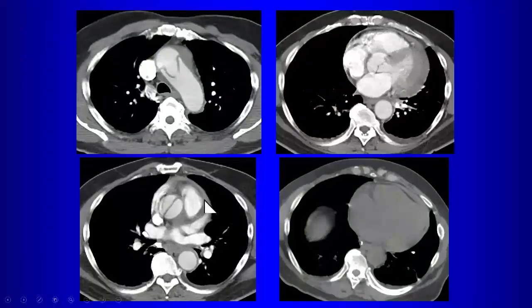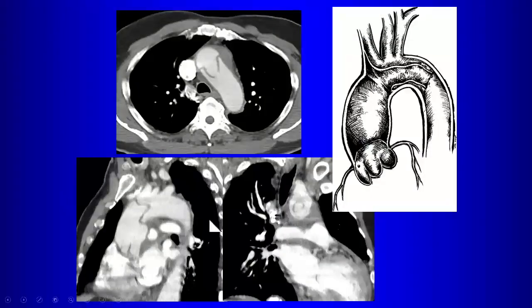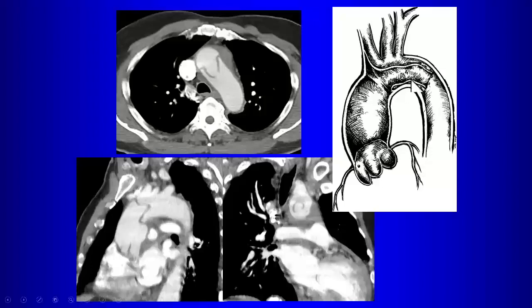Here is an unusual appearance: the dissection flap from the ascending aorta, during systole, is being pushed into the aortic arch, creating what looks like a tunnel in the aortic arch. A complication of this is obstruction of the great vessels coming off the arch.